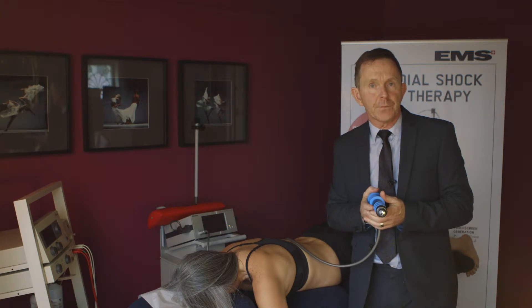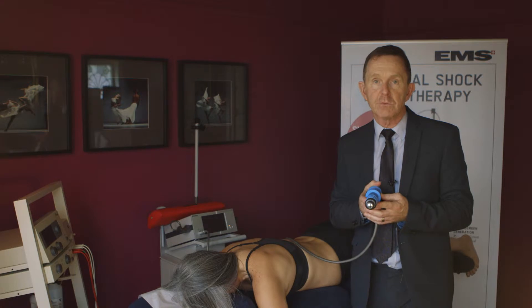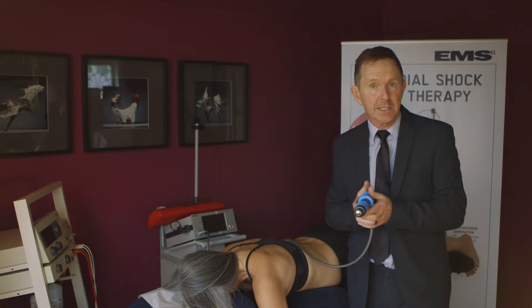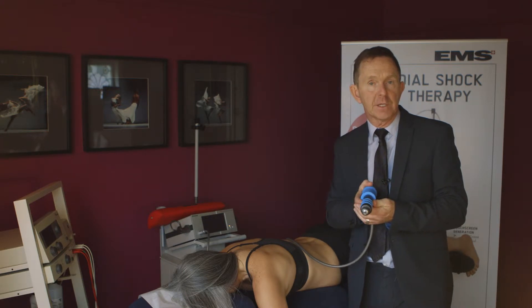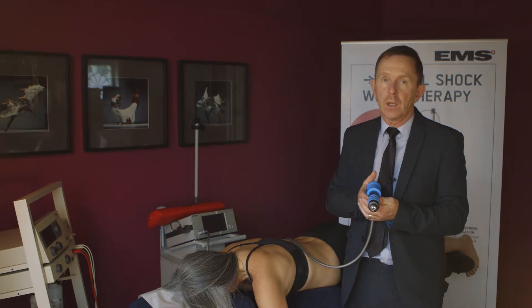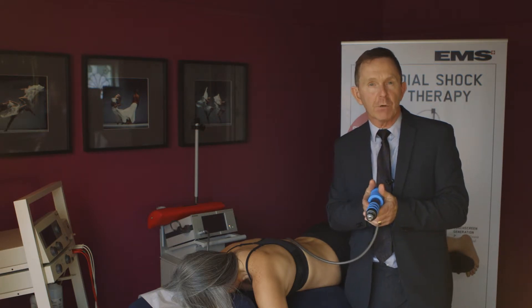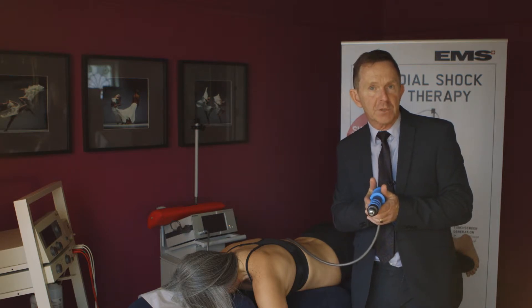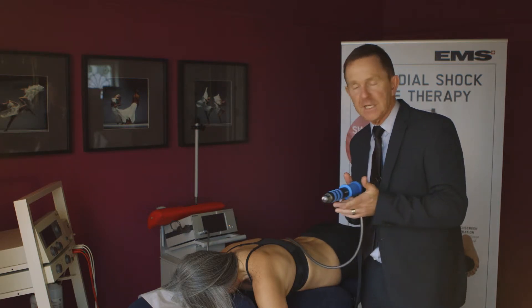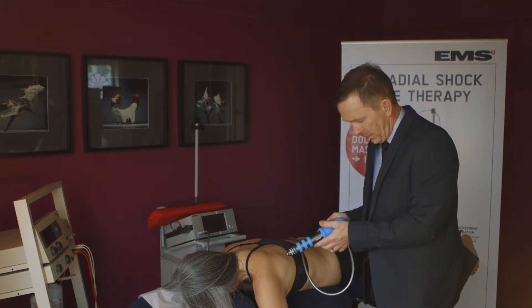So, handholds. This is very much an individual preference; however, I think it's really important that you connect and thereby you can control the head of this EVO Blue. It's also a good idea to think that it becomes part of you as you're working with the patient. You can feel the disruption within the soft tissues. For example, keeping the elbows in — the handholds can be slightly variable.